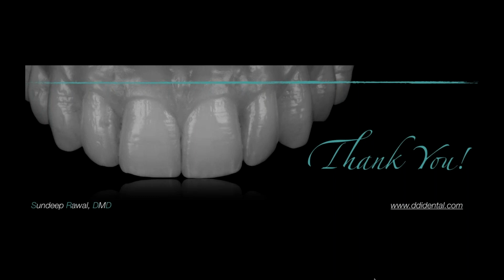It's robot-assisted dental surgery, where you're holding the handpiece, you're drilling, and the back of the handpiece is attached to a robotic arm. Same premise as navigation, where you can see on a computer screen where your drill is, you can drill to depth. When you get to depth, though, the robotic arm locks and you can't drill deeper.